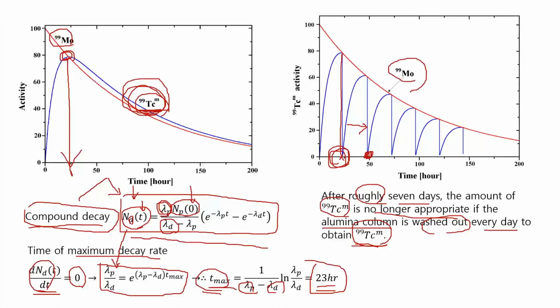First, we can use the cyclotron, and then we can use the nuclear reactor by neutron capture, or neutron capture followed by decay. And finally, we can use the radionuclide generator to obtain some specific radionuclides for SPECT.